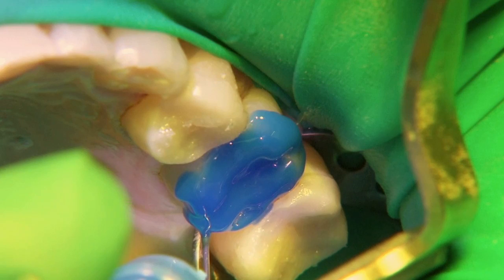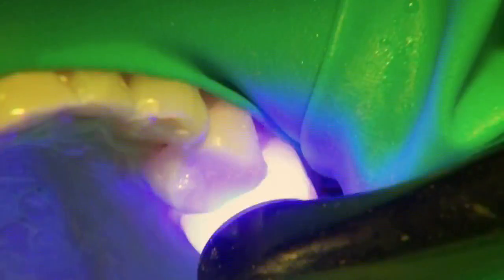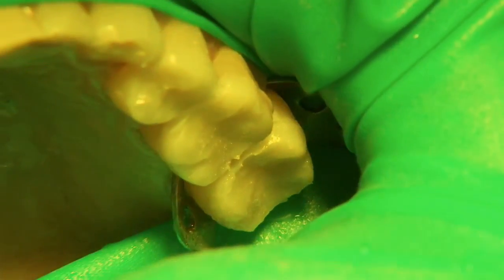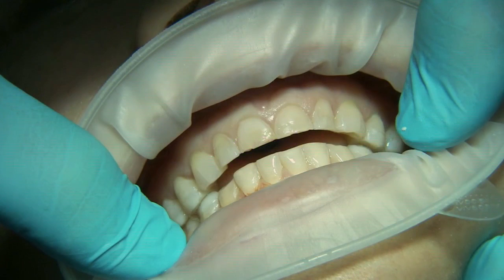And so again, just doing this a quadrant at a time. Very conservative, getting the cuspal morphology and everything back. So we would bond all 4 quadrants in. This is now the new vertical dimension.